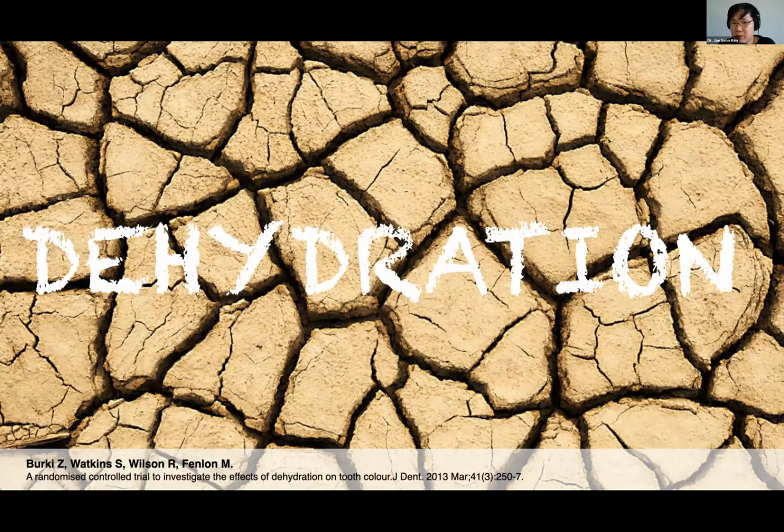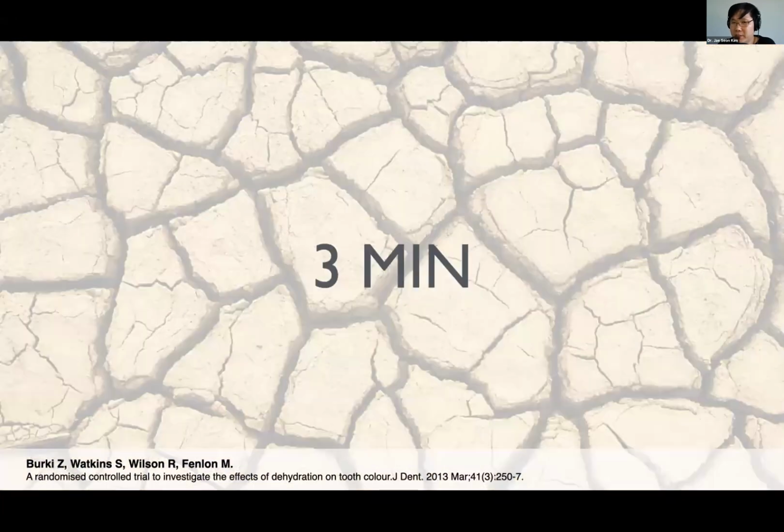Some studies say that the teeth can dry out in 3 minutes, and it can take hours or days for the tooth to rehydrate back, depending on the type of tooth that the patient has. So I really don't want to risk having the teeth dehydrated, because a lot of the time when the teeth are dehydrated, you take a photo, you send the crown. When you get it back and try it in, you get a very significant difference in the value, and the patients notice that very quickly and say, oh my God, this tooth is way too bright.